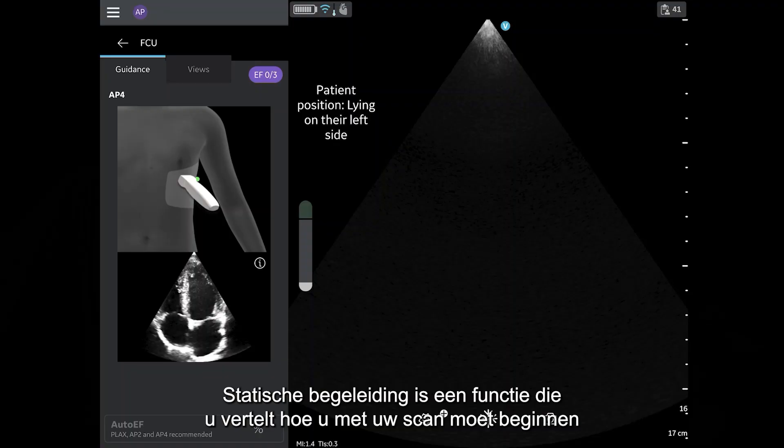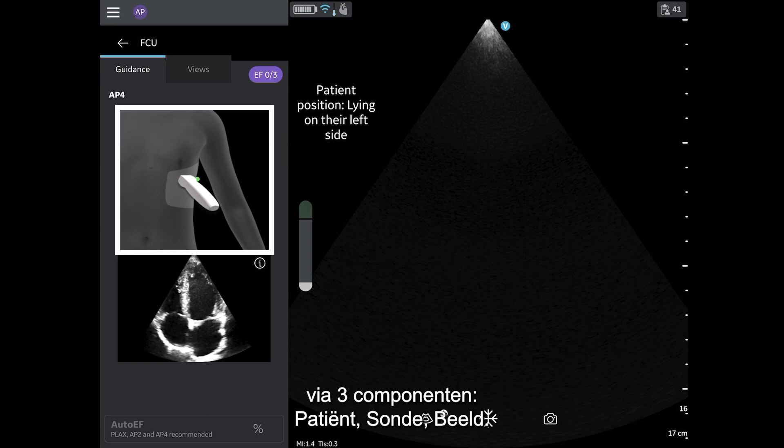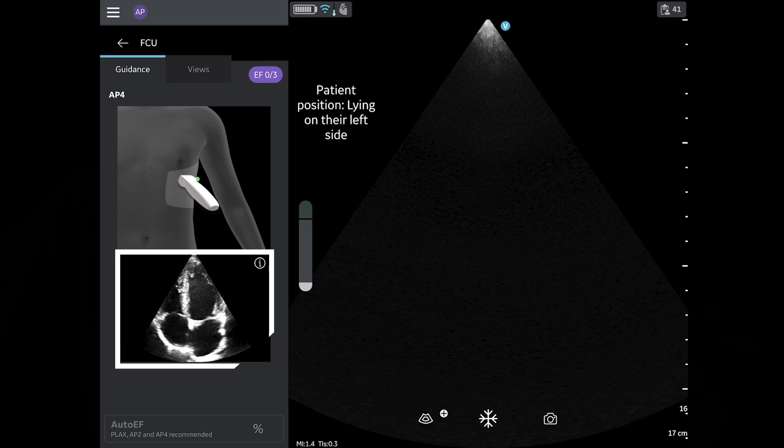Static guidance is a feature that informs you of how to begin your scan through three components: patient, probe, and picture.